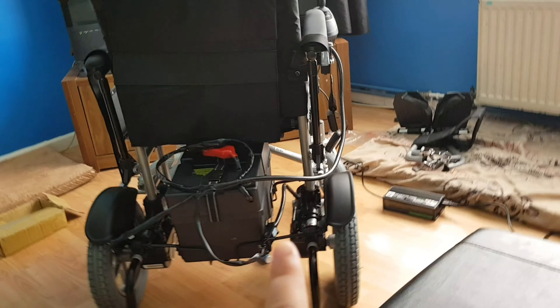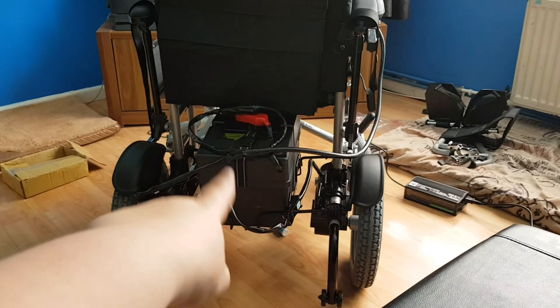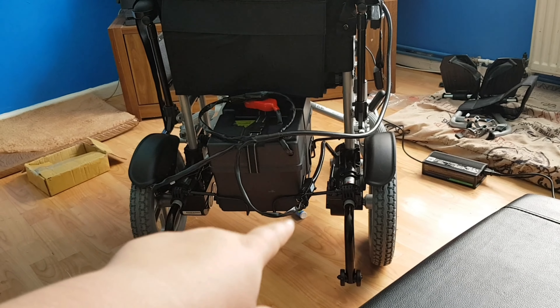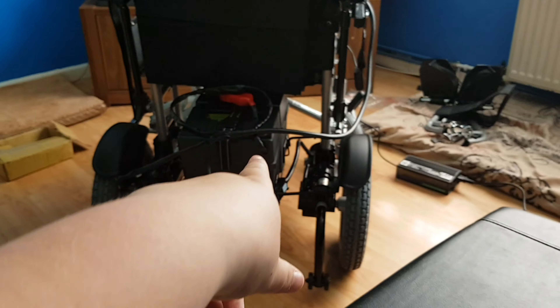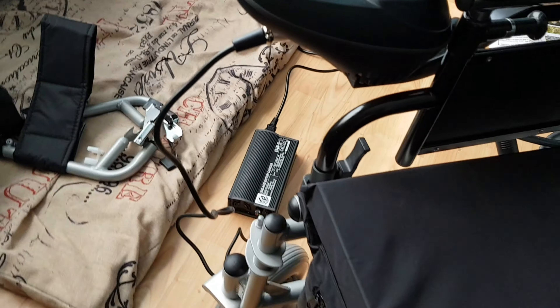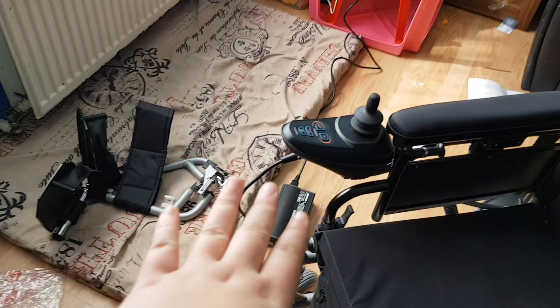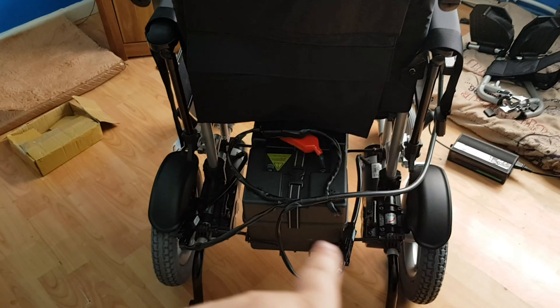I'm using my phone for this bit, but we finally managed to figure out the charging. You don't actually connect it to the charging boxy thingies — you basically connect them the way it says in the manual, like you would put it together. Rather than charge it to the side, you actually have it in to charge it, because then the charger connects up into here, and that's how it charges. Then you switch it on through the box and it makes a really funny sound. Overall, this looks really good. I think you're supposed to kind of tuck the cable away in the back so it doesn't get caught on something.